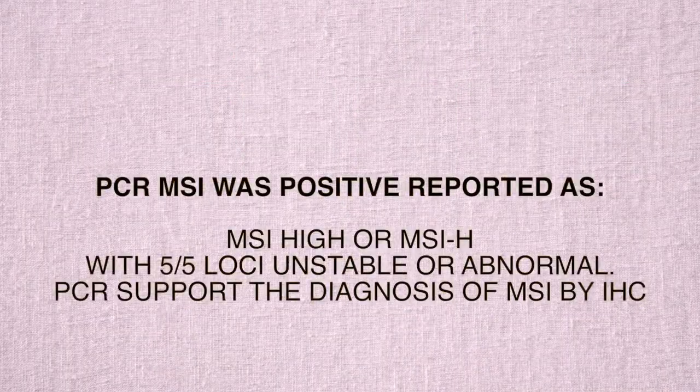Then we have the PCR. It was reported as 5 out of 5 microsatellites unstable. So it's definitely a positive case for microsatellite instability, reported as high.